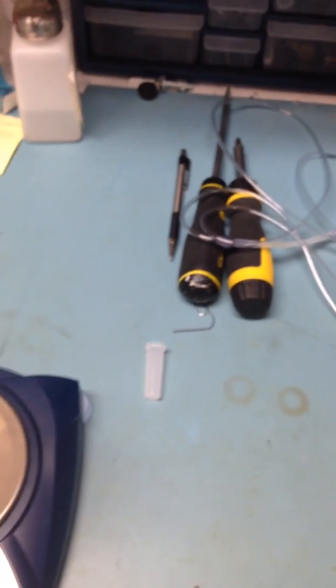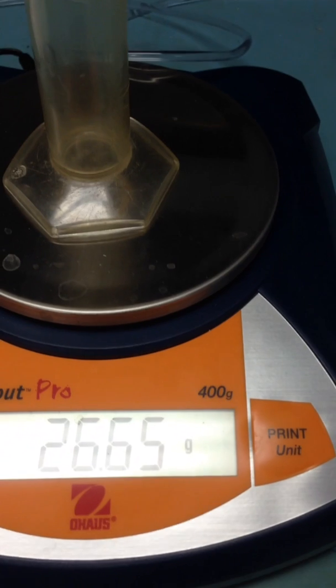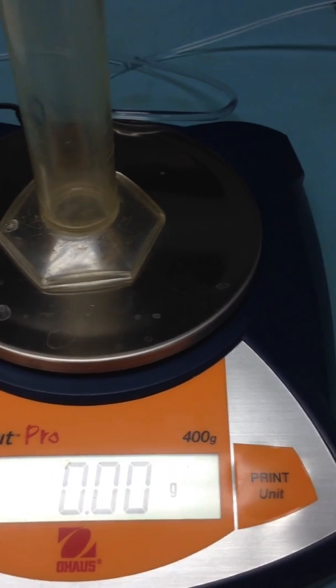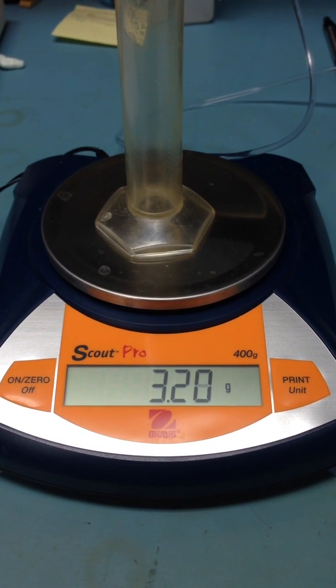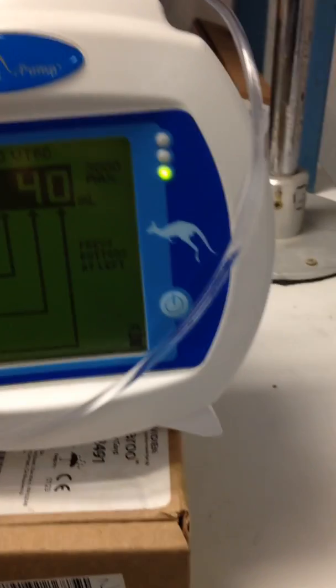This is a cylinder and scale. We want to zero out the cylinder so that we can measure how many grams and milliliters we're going to get. Now we can start — press enter and you get the option to run, which is what we want to do.